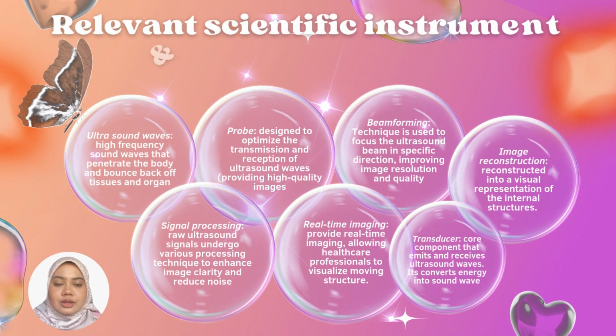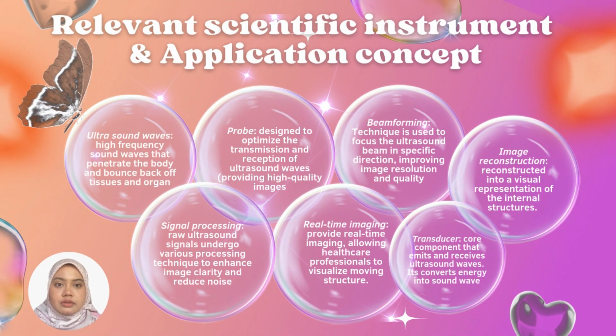Next, I would like to explain the relevant scientific instrumentation and application concepts. First, the transducer. The transducer is the core component that emits and receives ultrasound waves. It converts electrical energy into sound waves and vice versa. Piezoelectric crystals are commonly used in transducers due to their ability to generate and detect ultrasound waves.